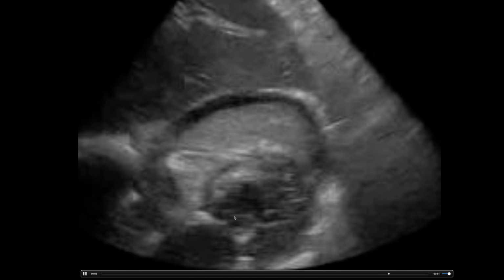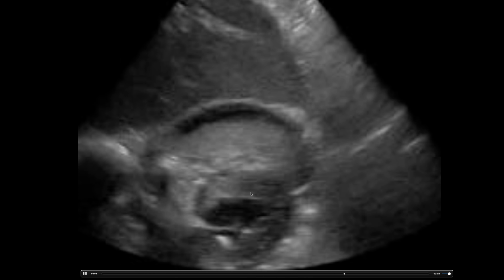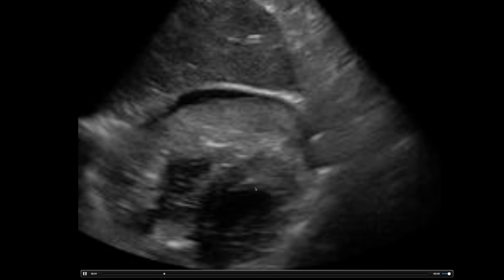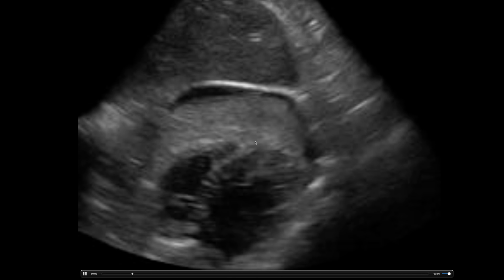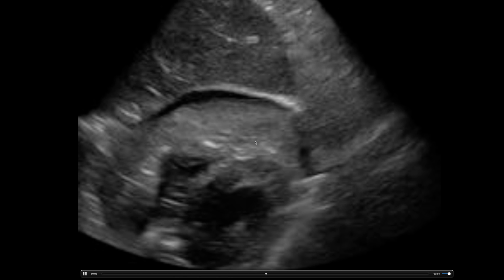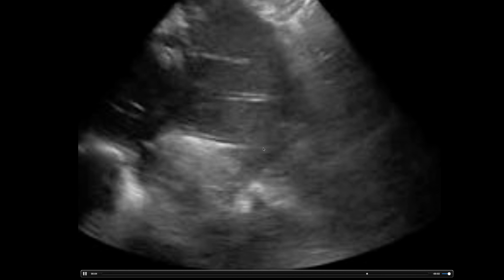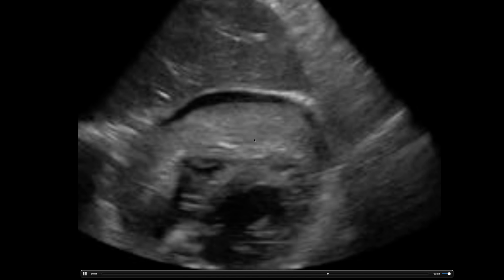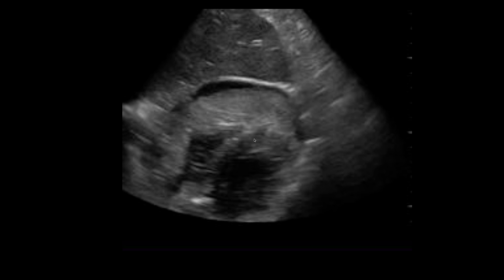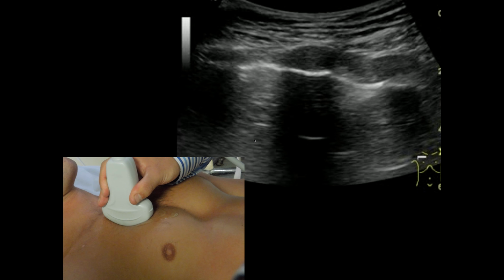You can see just a minuscule amount of movement in the heart. So this patient had a stab wound to the chest and was in PEA arrest with barely any heart activity. And this was actually called a negative scan. This was not at an institution, thankfully, that I was at, but at a colleague's institution. And this patient did not have their chest cracked, which you could argue should have been done, although the mortality would be astoundingly high either way. So we've gone over that.